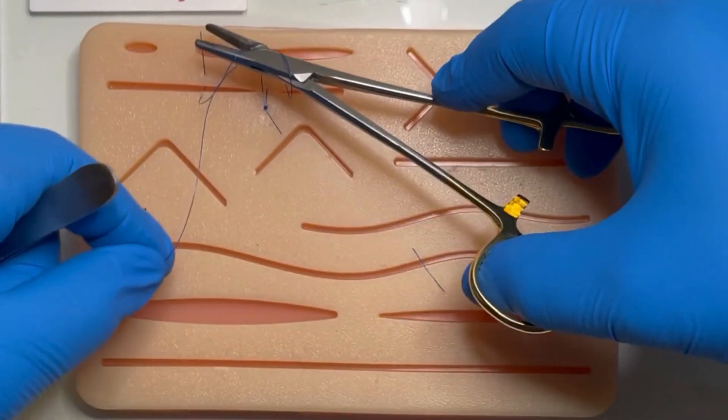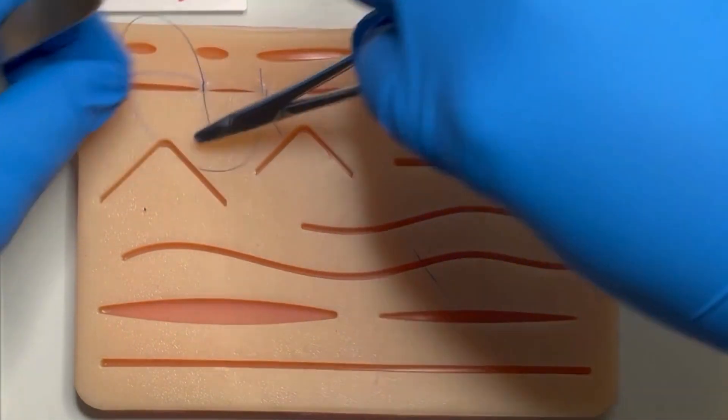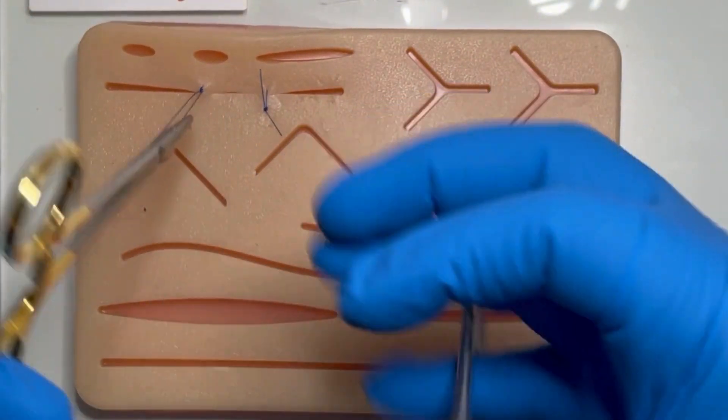Place the needle holder between the suture ends parallel to the wound. Tie a surgeon's knot, then two reef knots. After each knot, your suture ends are laid to the opposite side.